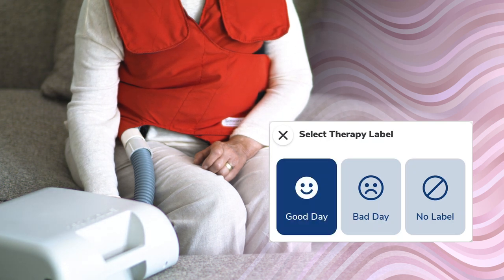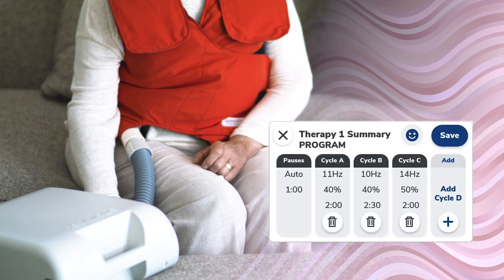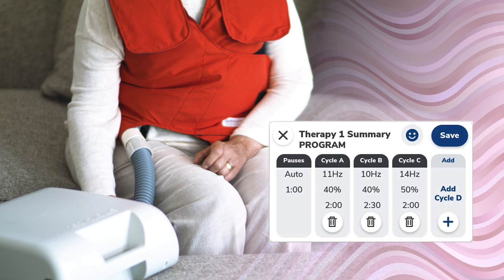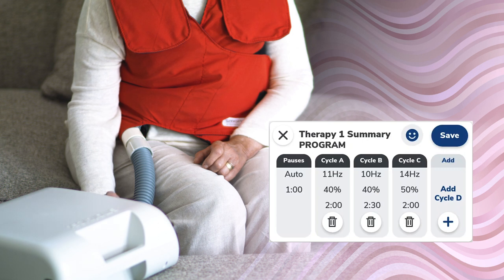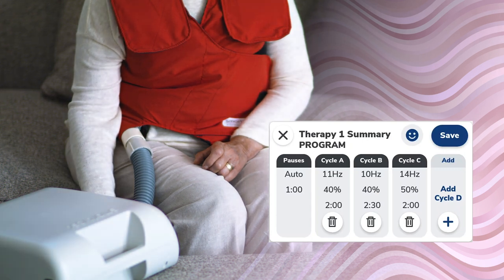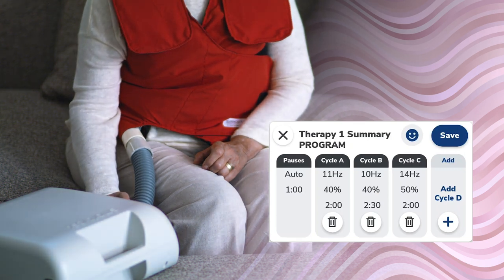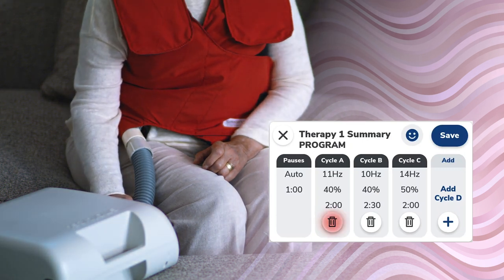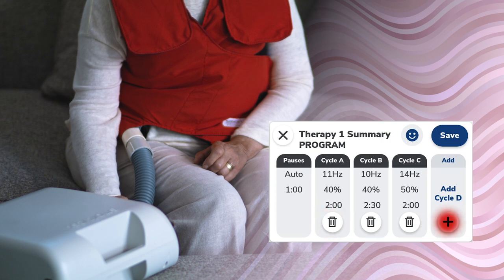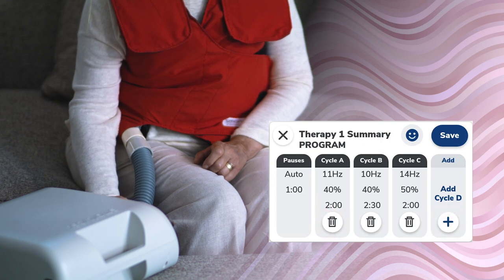After all program therapy selections are made, the summary screen will present with the entered therapy settings. Press anywhere on the gray pause or cycle boxes to edit the selected cycle frequency, pressure, or duration. Tap the trash can to delete a cycle or the blue plus sign button to add a cycle.